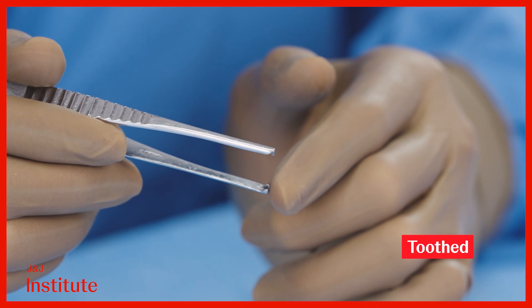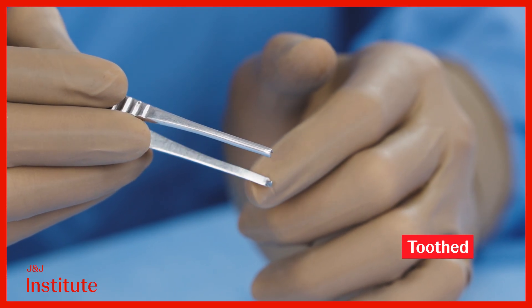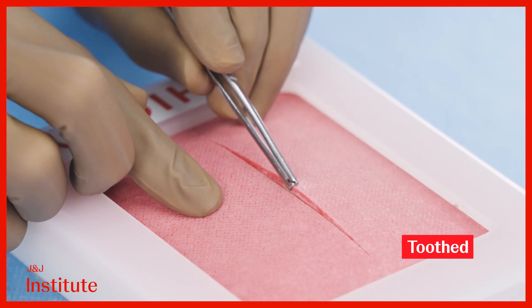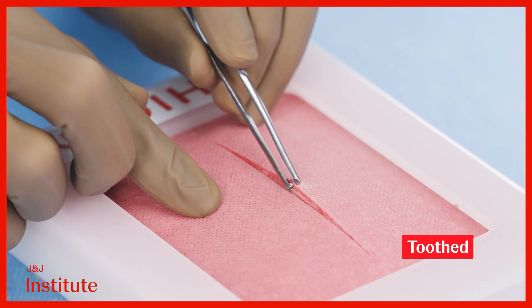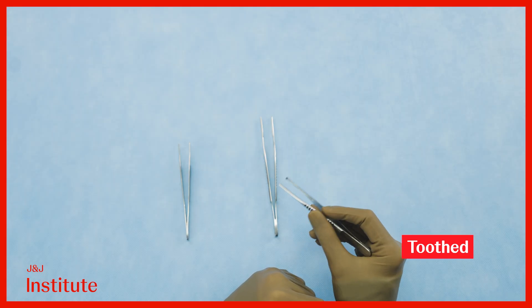Most tooth forceps feature two teeth on one side and a single tooth on the other. When manipulating skin, it is important to position the jaw with more teeth within the incision to minimize trauma to the skin surface. This aids healing as well as cosmesis.